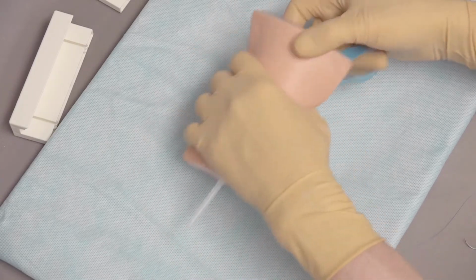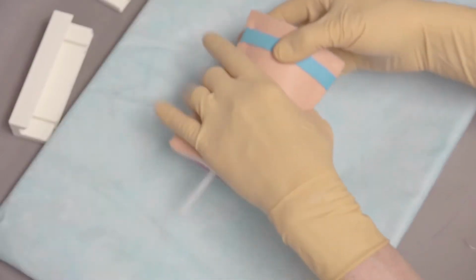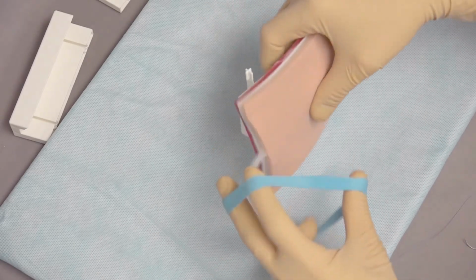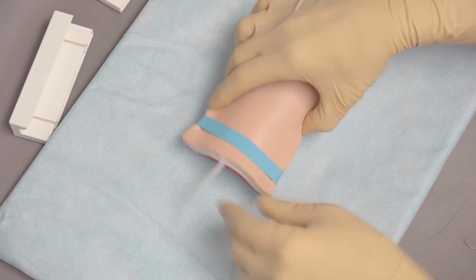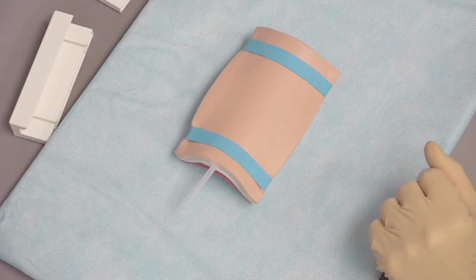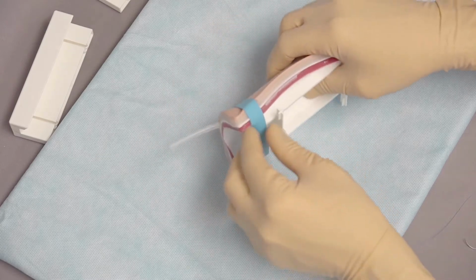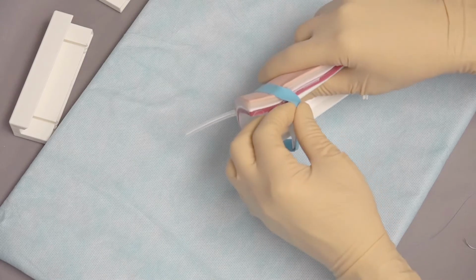of the tensioning base. Pull that down, and then we can use the rubber band that comes with the tensioning base to hold that end, and a second rubber band to hold the other end. So this doesn't hold it really tight, but it does help to hold it in position and will help to open up the vessels a little bit easier for the surgeon to be able to do the procedures. We're going to pull these in. I'm going to tighten them down around the bottom here and here so that we can hold that a little bit tighter.